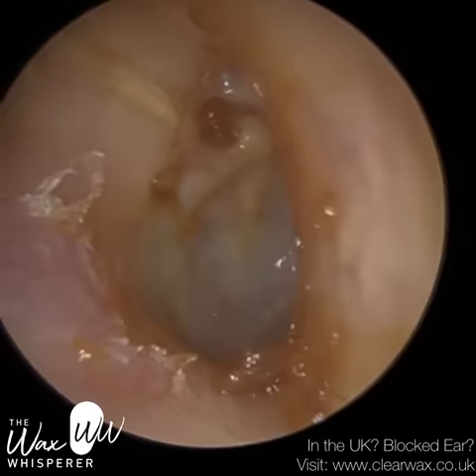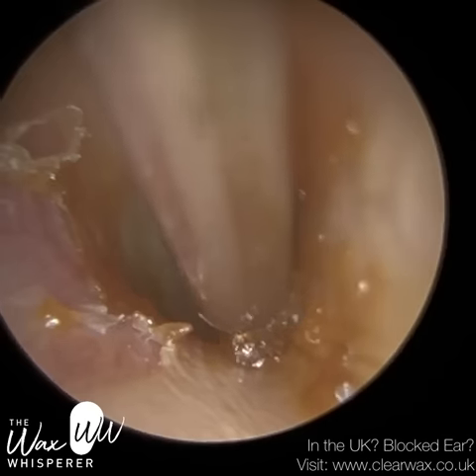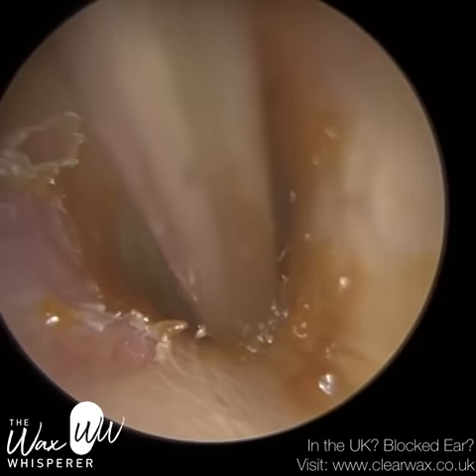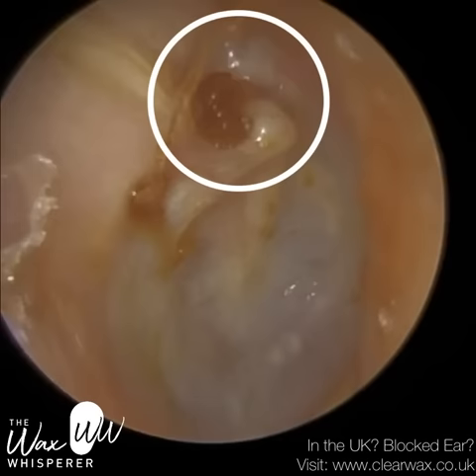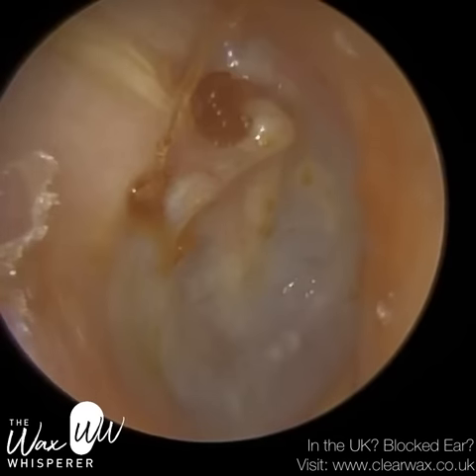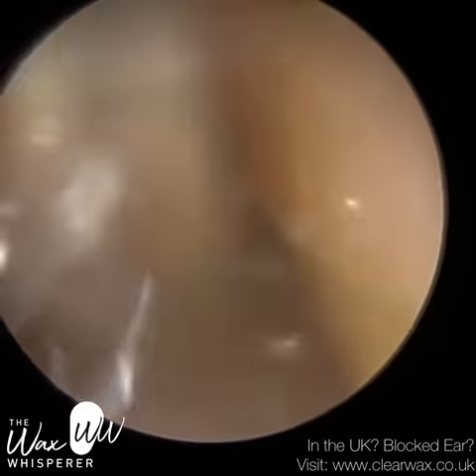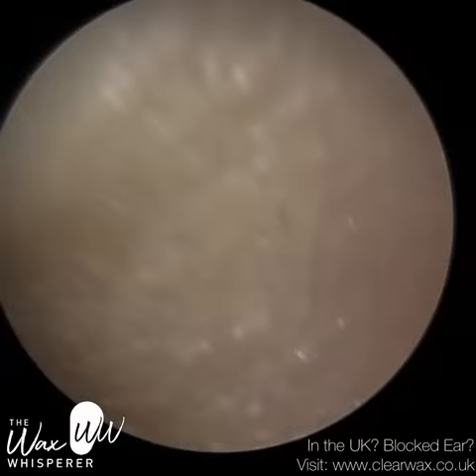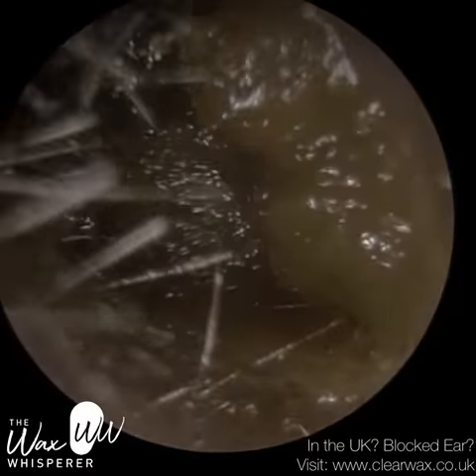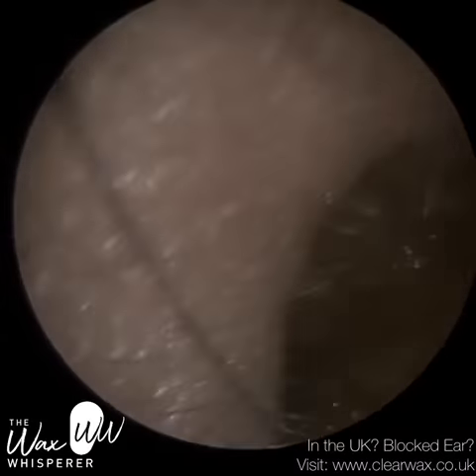I'm going to circle that on screen now because we've just cleared all this wax. There's a bit of wax in the attic retraction, but it's not ingressed — if I placed a sucker there it would probably touch the hammer bone, which would be uncomfortable, so I'm confident it's not ingressed. That circular region is what we call the pars flaccida, the attic region of the eardrum. In this patient the attic is retracted — sucked in due to negative middle ear pressure. That part of the eardrum is prone to retraction because it's thinner — hence the name pars flaccida — compared to the rest of the eardrum called the pars tensa.